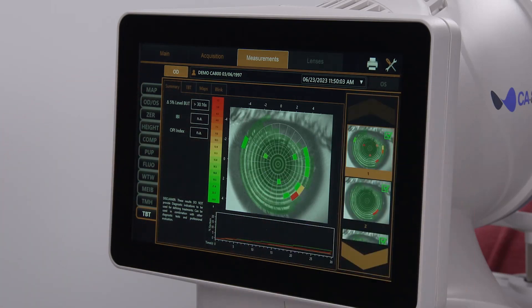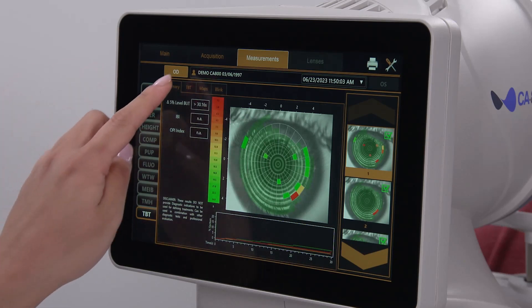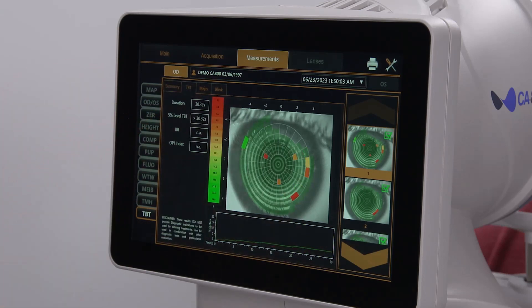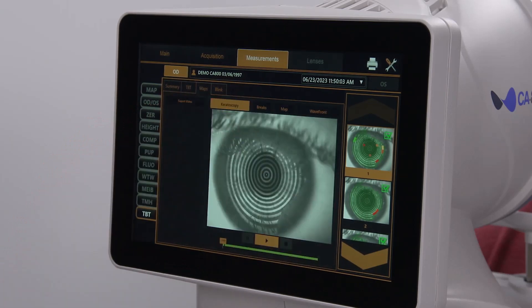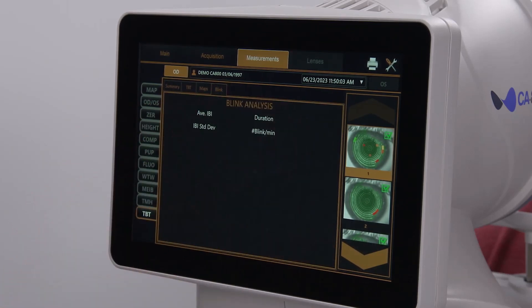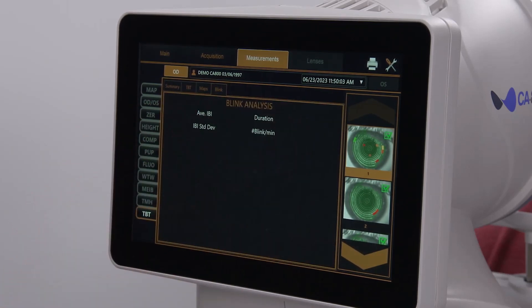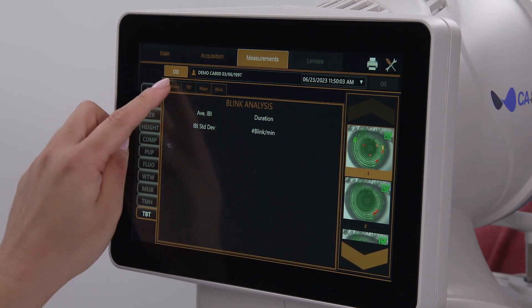There are four tabs near the top of the screen: Summary, TBT, Maps, and Blink. The default is the Summary tab, which displays metrics based on the combination of a tear breakup acquisition and the blink analysis from a particular visit.